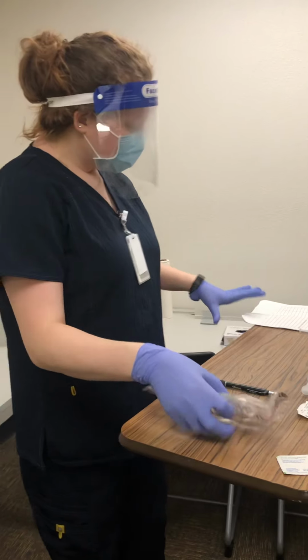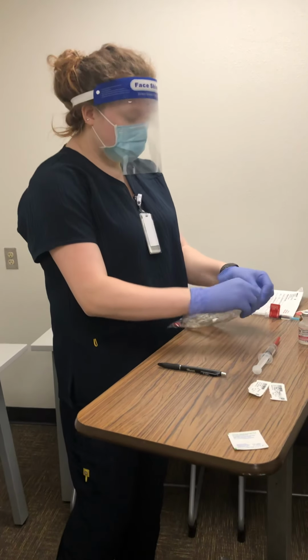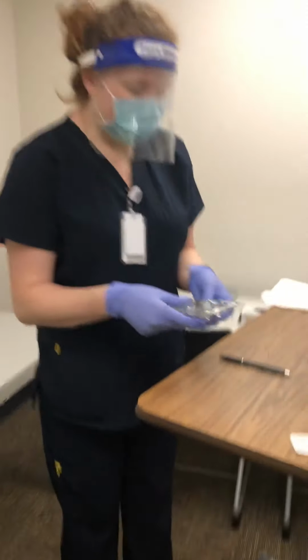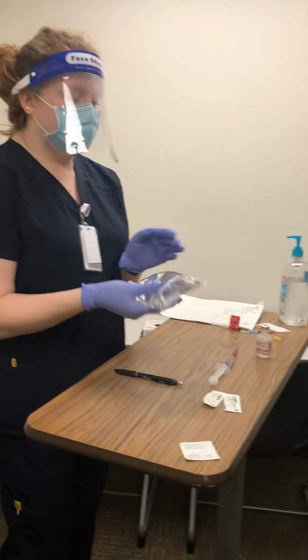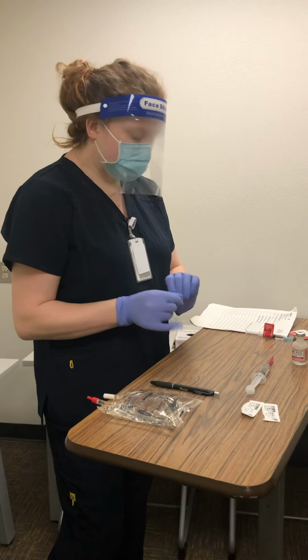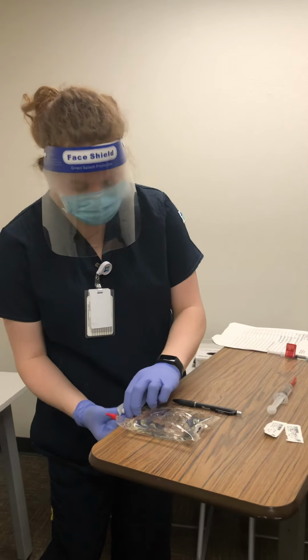Alright, so now I'm going to do first med check for my normal saline, and I'm going to open my package. I'm inspecting the integrity of the package, making sure there's no discoloration, it's not wet, nothing like that. So what I'm going to do now is double check that. I'm going to clean this port for 30 seconds, and we'll let it dry.